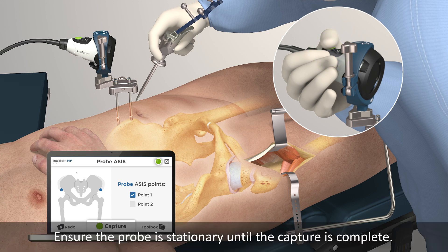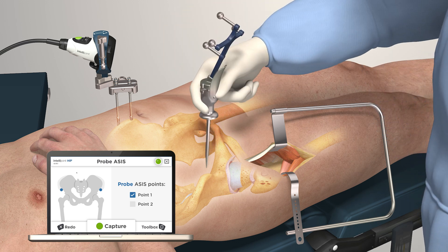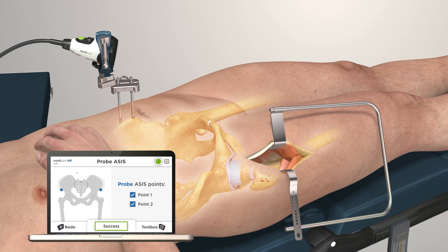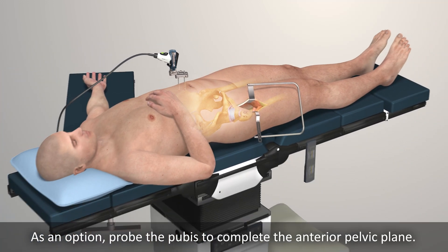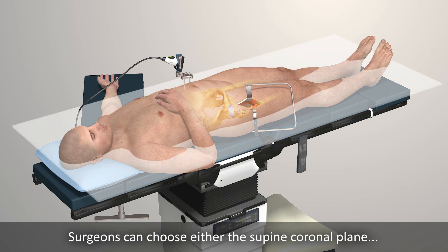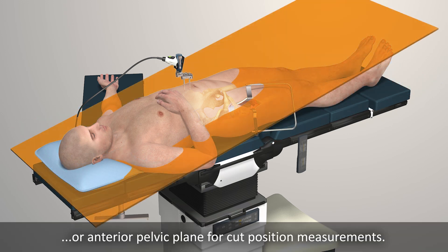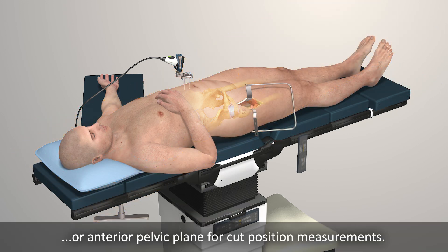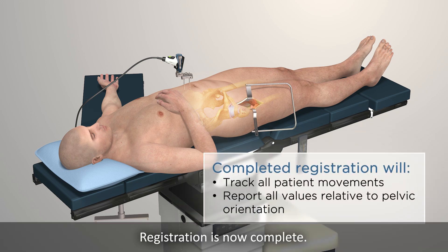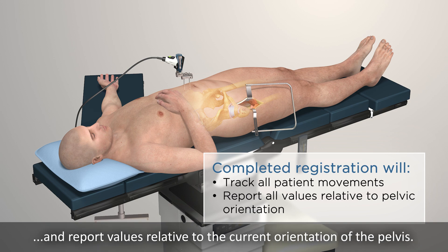Ensure the probe is stationary until the capture is complete. As an option, probe the pubis to complete the anterior pelvic plane. Surgeons can choose either the supine coronal plane or the anterior pelvic plane for cup position measurements. Registration is now complete. IntelliJoint Hip will now track any patient movement and report values relative to the current orientation of the pelvis.